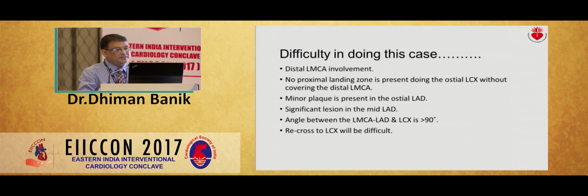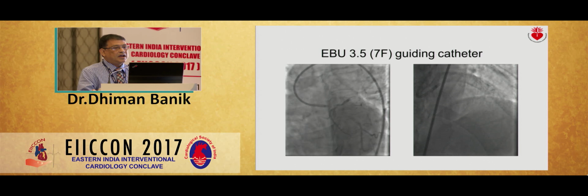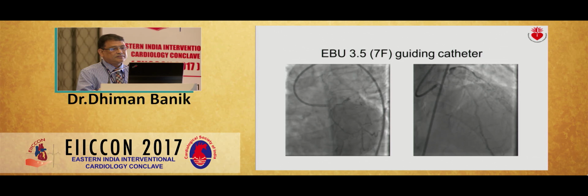A minor plaque is present in the ostial LAD, and the mid-segment LAD is significant. And the angle between the left main and LCX is more than 90 degrees. So recrossing of the LCX will be difficult. With these things in mind, I went for PCI of this patient. I took an extra backup catheter of 7 French.